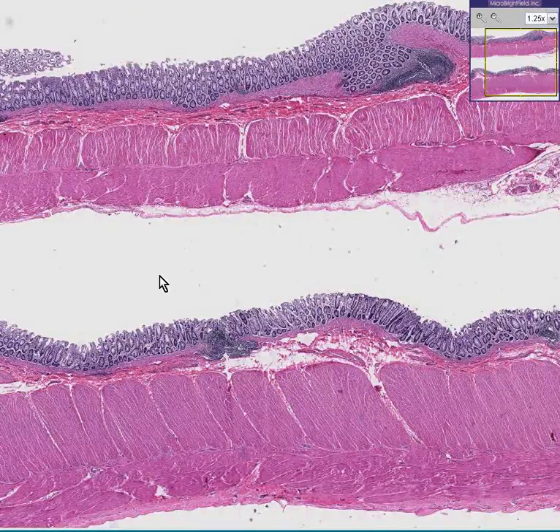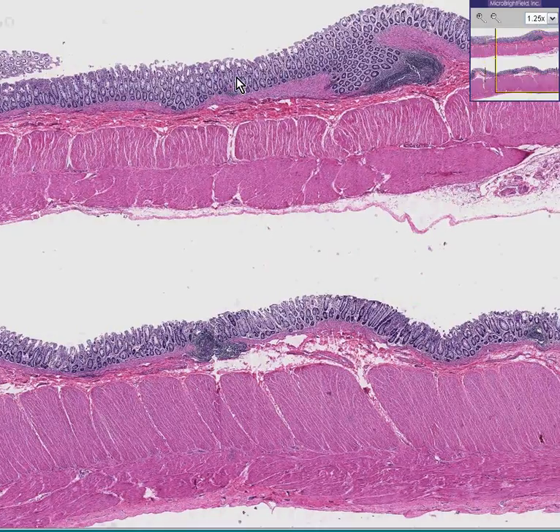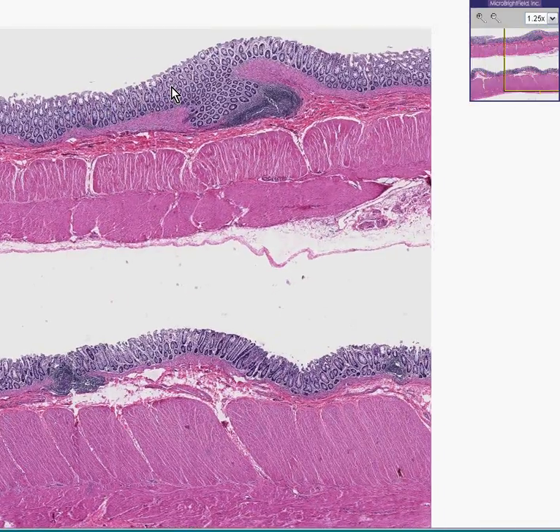I know you're thinking, why should I be showing you normal large intestine? Well, if you really look closely and you go through all the classical normal histology of a colon, you can see a normal mucosa, a normal submucosa, a normal circular layer, a normal longitudinal layer, and so on. Some lymphoid follicles out there in the submucosa extending to the mucosa, normal glands, no inflammation, no neoplasm. So you think this is normal.